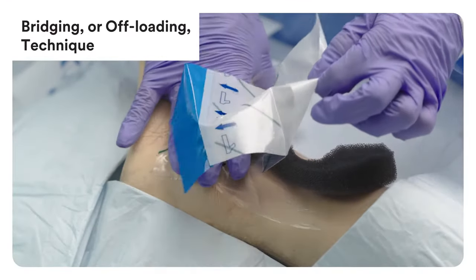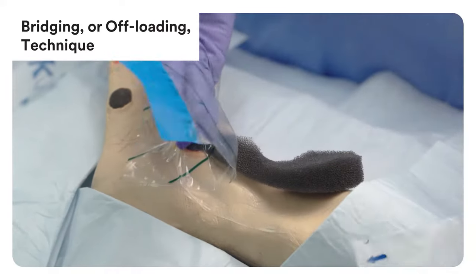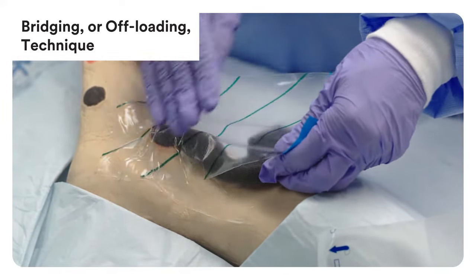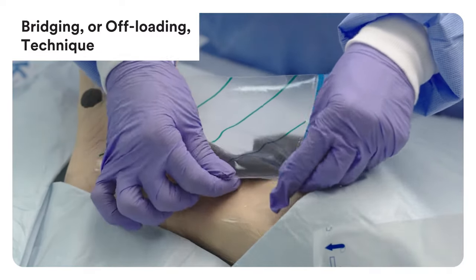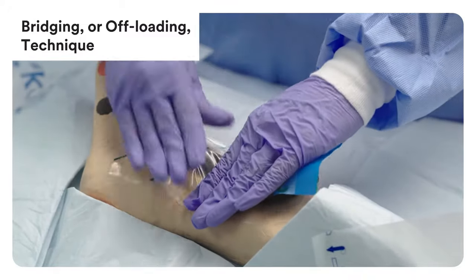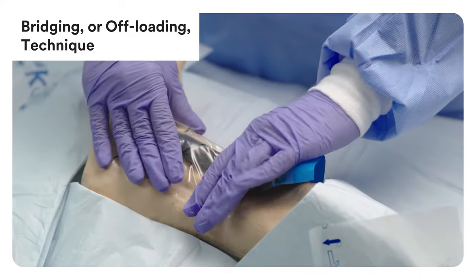Bridging or offloading technique is a good option for patients with wounds on weight-bearing areas where it is important to minimise the chance of creating additional pressure points. Appropriate offloading of the foot is essential in order to maximise the therapeutic benefits of VAC therapy.